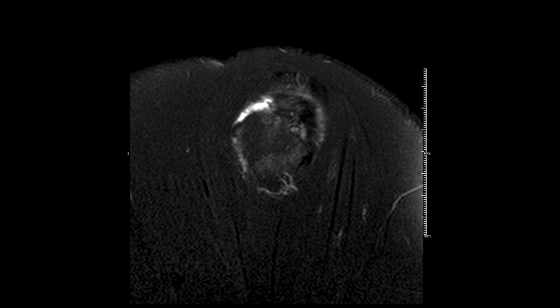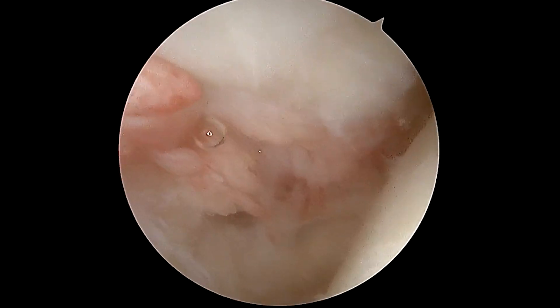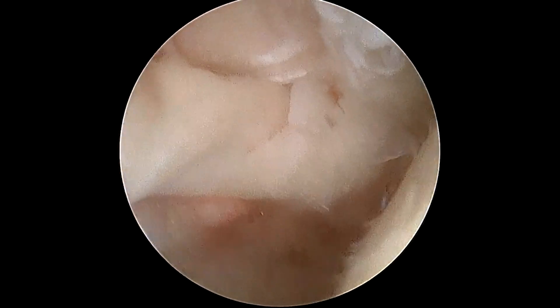This is now a sagittal view, so we're looking at the patient from side to side. The front of the shoulder is the left of the screen, and the right side of the screen is the back side of the shoulder. Again, the white area is the tear in the rotator cuff tendon — that's fluid where we're actually supposed to see tendon. We decided to go for surgery because the patient was young and active and had an acute rotator cuff tear with significant weakness.